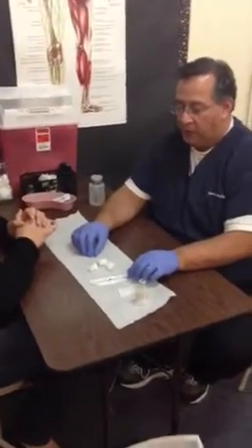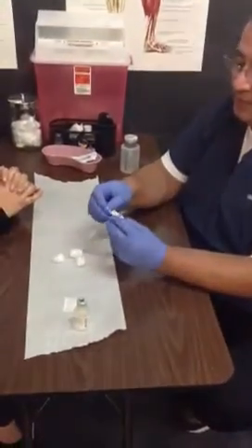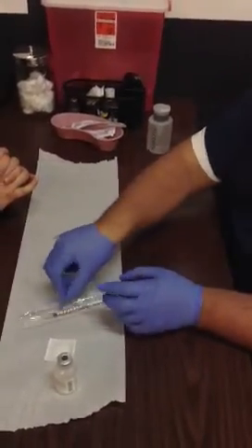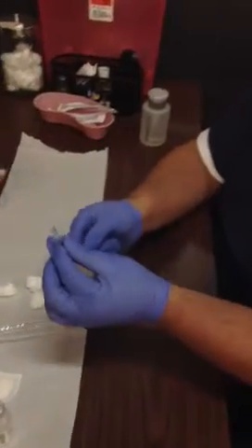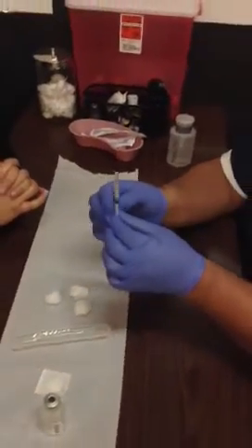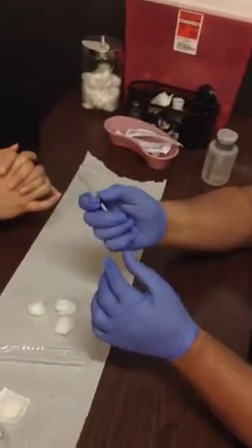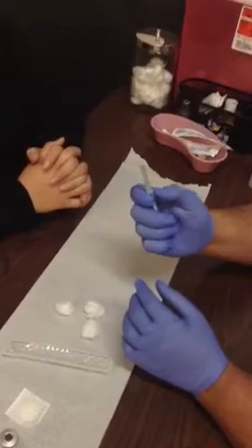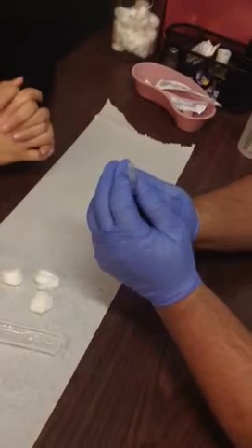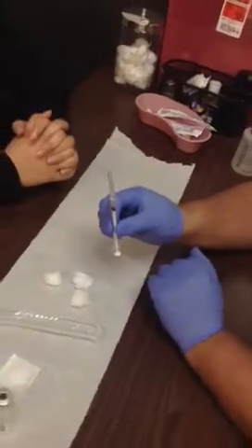At this point we're going to go ahead and prep our supplies. We're going to take the back side of the syringe wrapper off and throw that away in the trash. Then you're going to prep your syringe — loosen the plunger first, pull it down once, then push it all the way back up. Grab the hub firmly with one hand and the barrel with your other fingers. Then take your other hand and push the cap up so that it's loose — we just want to loosen it up, not take it off. Now your syringe is prepped.